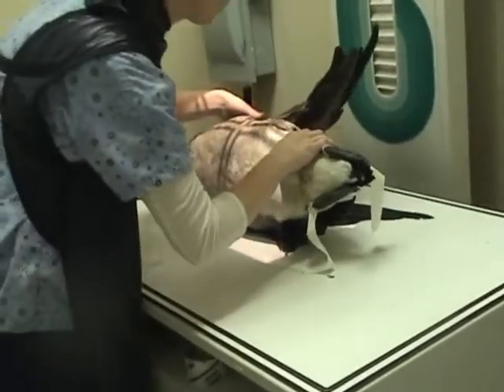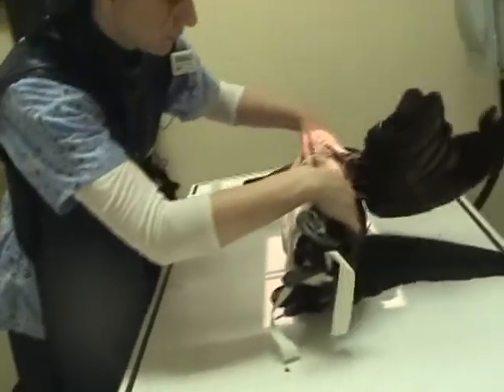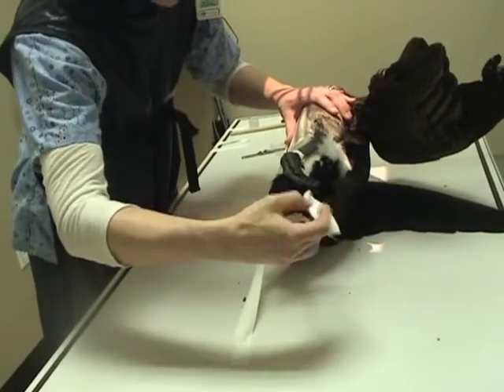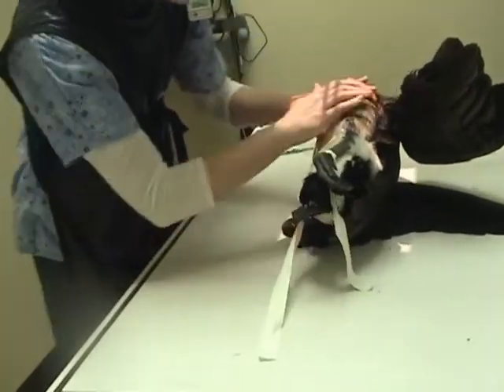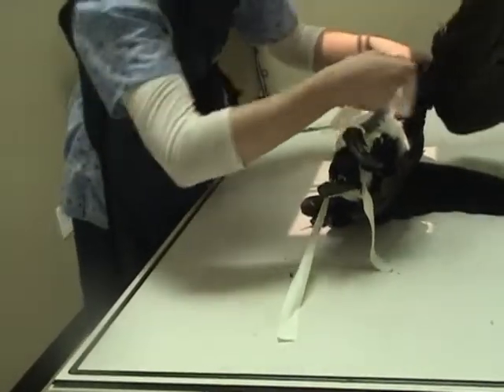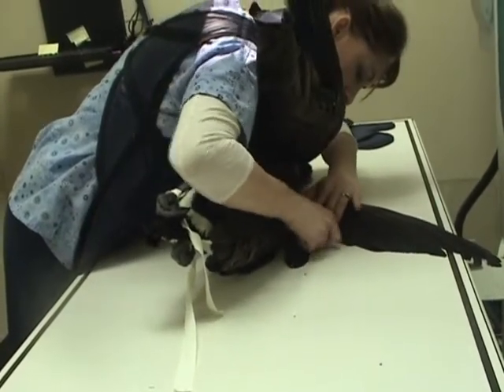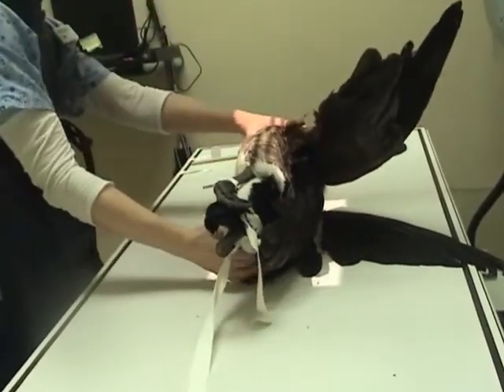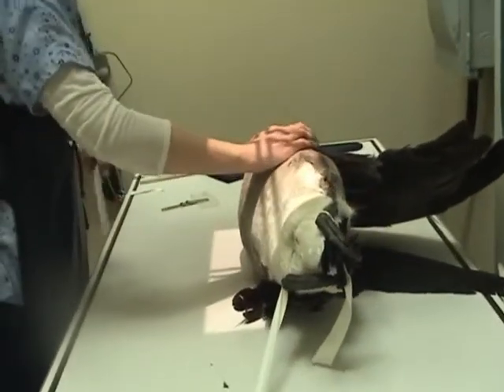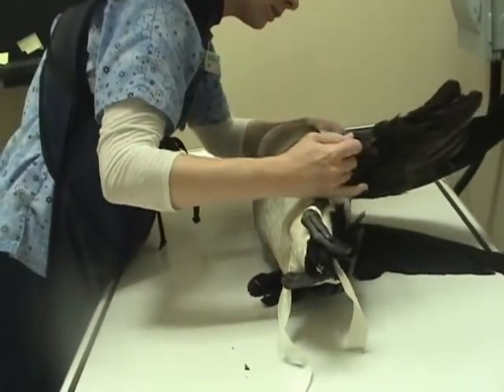For the lateral view of the whole body, the bird is placed in right lateral recumbency. The wings are extended dorsally, directly above the body of the patient. The wing that is down on the table should be positioned more cranial than the upwing and secured with tape. You also want to use the tape again to extend the legs caudally and secure them to the table. Again, since this patient was deceased, it was a little bit more challenging to get the wings to stay in the position that we wanted them to be.